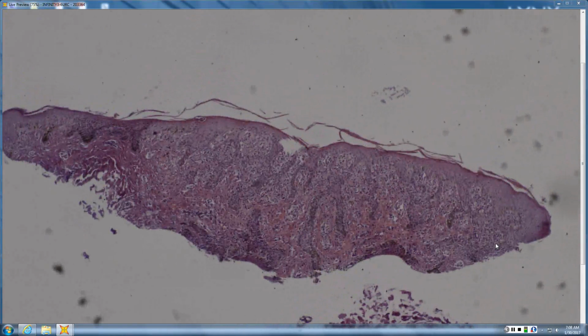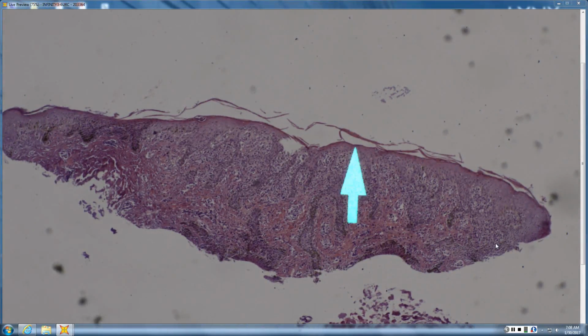Usually an interface dermatitis or vacuolar, lichenoid, some sort of interface dermatitis usually over time produces effacement of the rete ridges and not this psoriasiform, and in this case more the slender psoriasiform hyperplasia. So when you see those two things together, that all this infiltrate that's creating a little vacuolar interface dermatitis that's then combined with this psoriasiform slender hyperplasia, that really makes you think of syphilis.